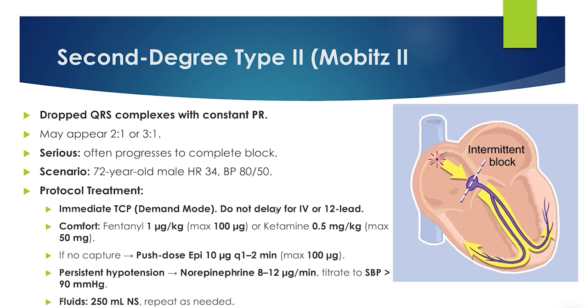We're going to start pacing. Want to get an IV established right away, and then like I said, atropine usually wouldn't work in that case. So pacing is uncomfortable for the patient, causes pain because you're constantly delivering electric shock to them. So we can try to give them some pain medication. I will hold off until we get some improvement in the blood pressure, because any pain medication that you give with that blood pressure can cause even further hypotension as well.